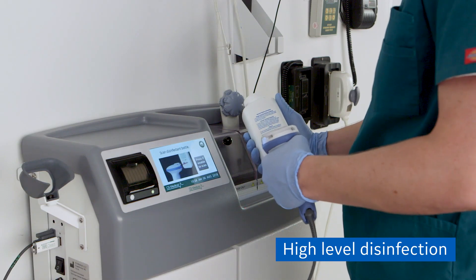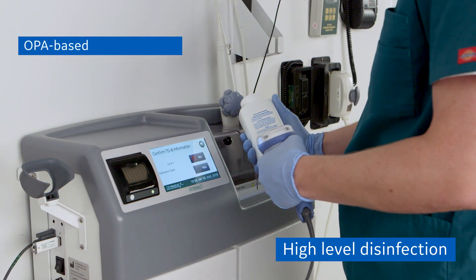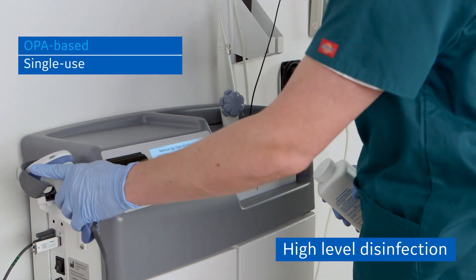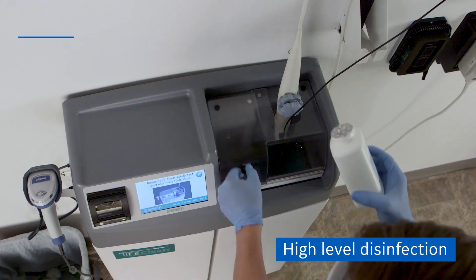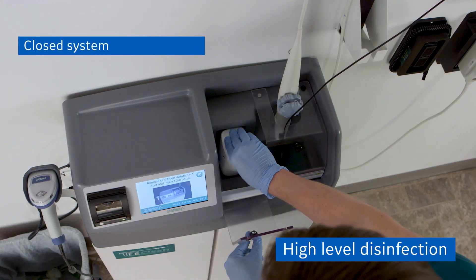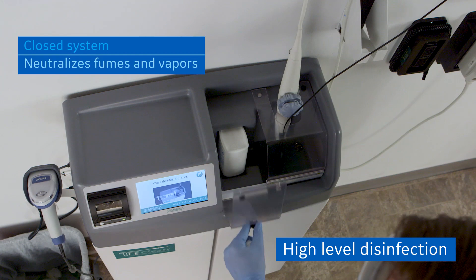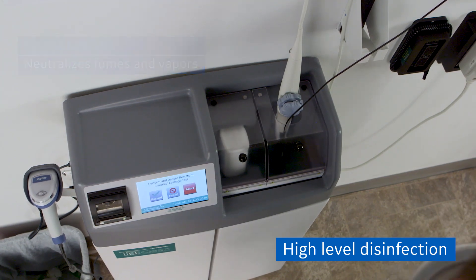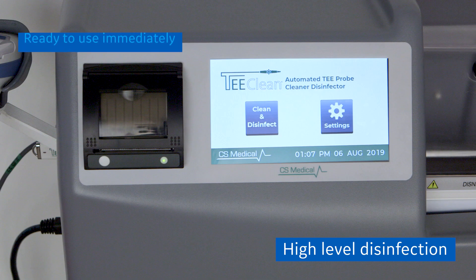The T-Clean uses TD-8, an OPA-based single-use disinfectant. Single-use minimizes the concern over foreign material contamination. It is a closed system with an advanced vapor management system that captures and neutralizes fumes and vapors from the disinfection process. The system is ready to use immediately, with no waiting to heat an entire gallon of disinfectant.